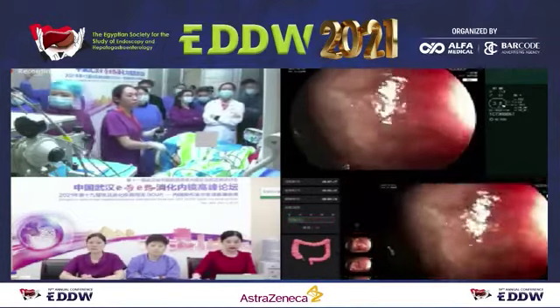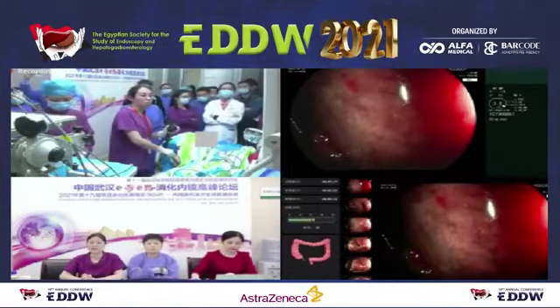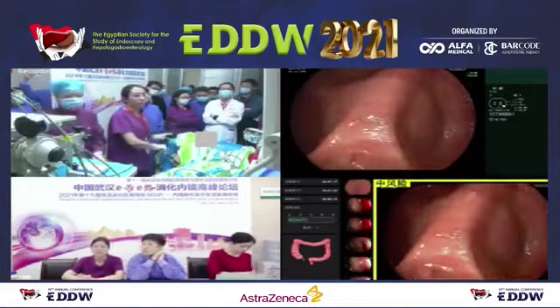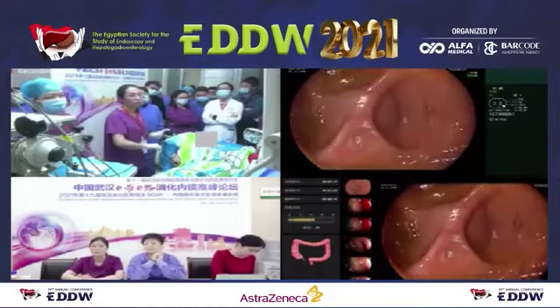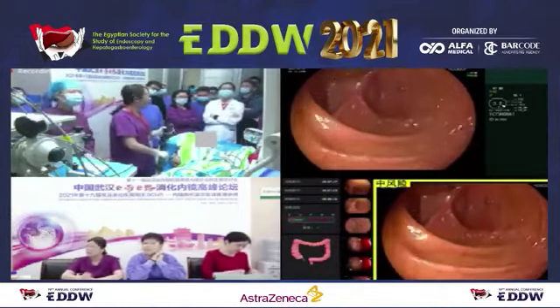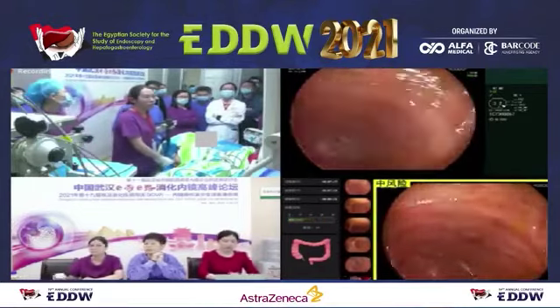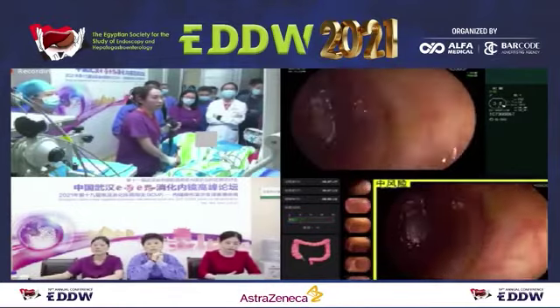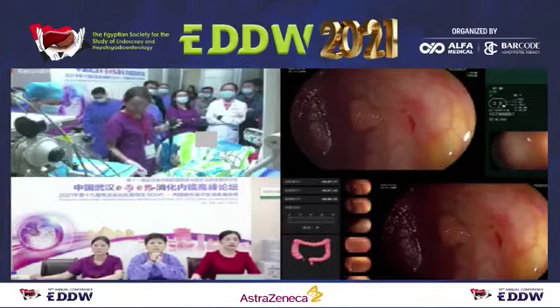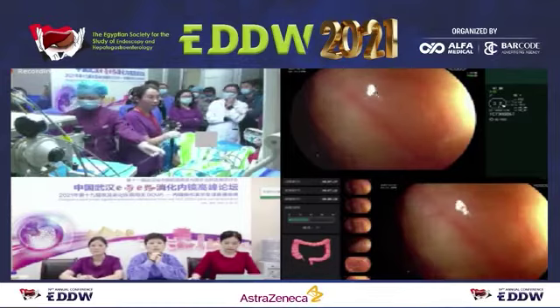Come to the normal mode. Yeah, normal mode. So for this we finished. Next, I'll do the EMR for this patient.